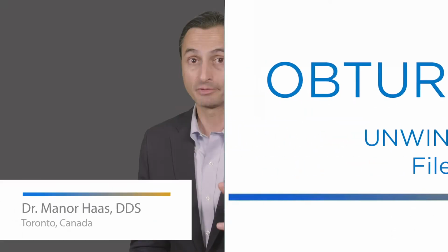We don't talk enough about files that may unwind, nickel titanium mechanized files. So imagine you're using your file, you know your working length is 20 millimeters. Well, what if you're using a file that unwinds very easily? Not great quality, unwinds very easily. So now you're trying to instrument, the rubber stopper is at 20 millimeters, but it unwound and stretched a millimeter.